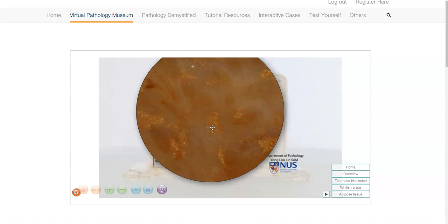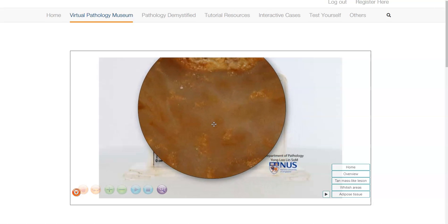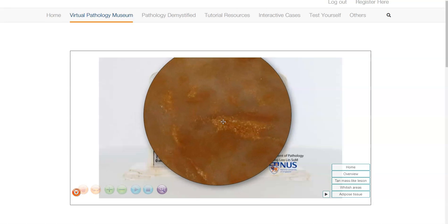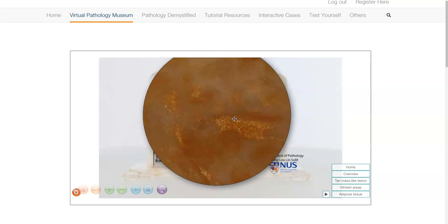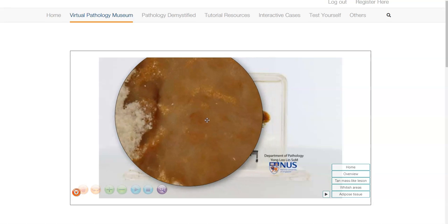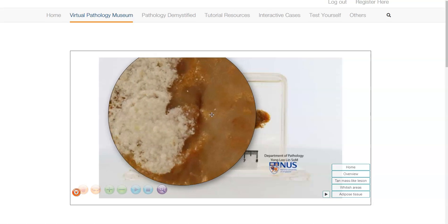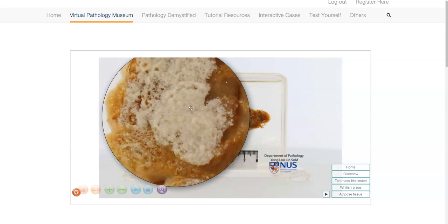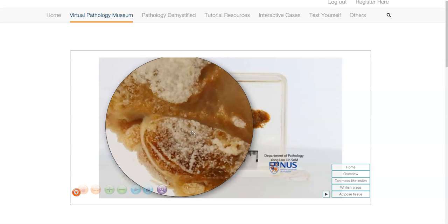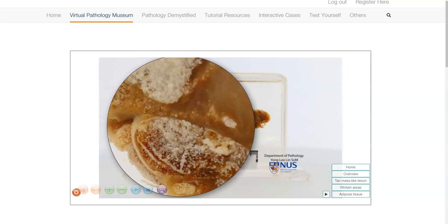We can see that there is some degree of variation in colour. We have whitish areas, which show the fibrous tissue and breast parenchyma, and then we have some yellowish areas, which represent fatty tissue, and over here is fatty tissue showing some degradative changes.